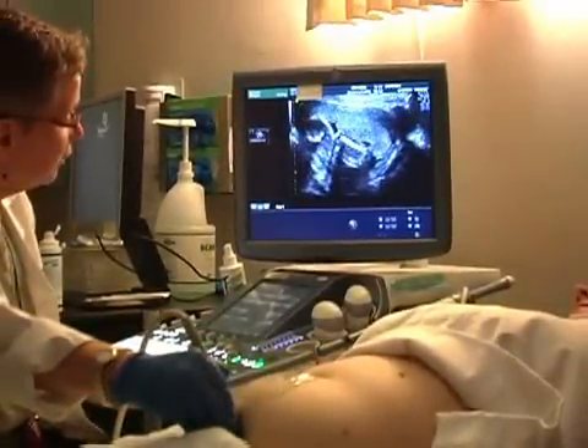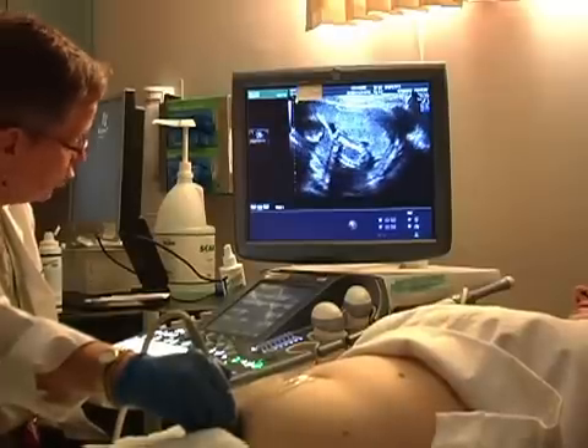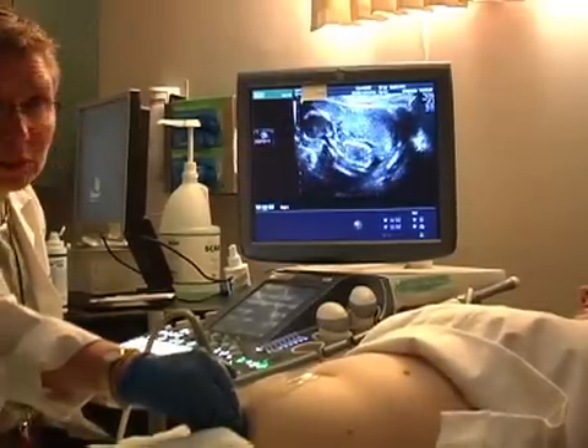So this fetus is kind of partway between a breech presentation and a transverse presentation, so I would call this breech oblique.